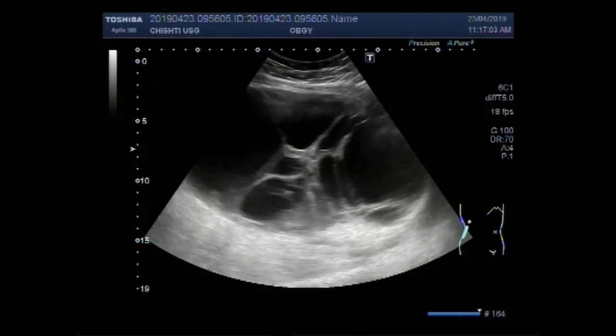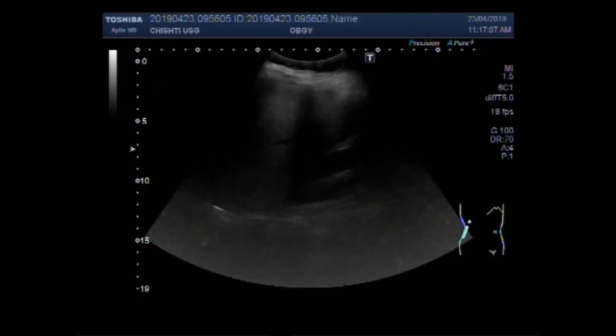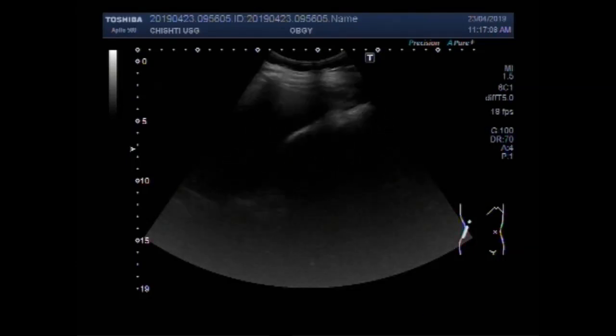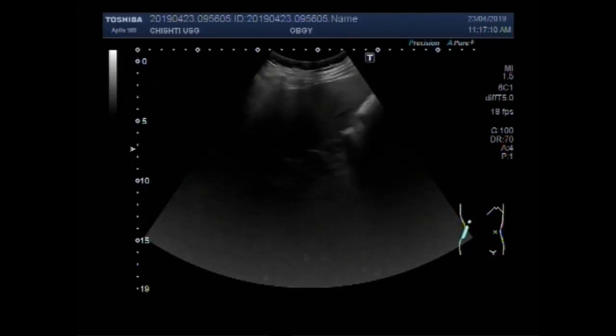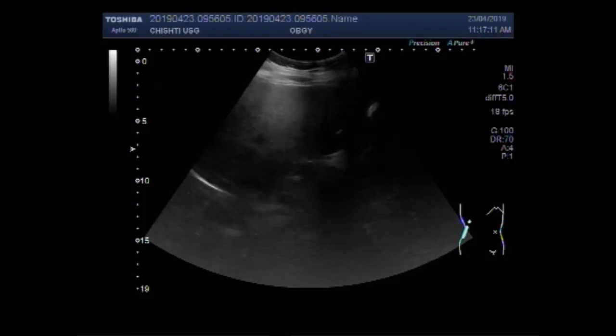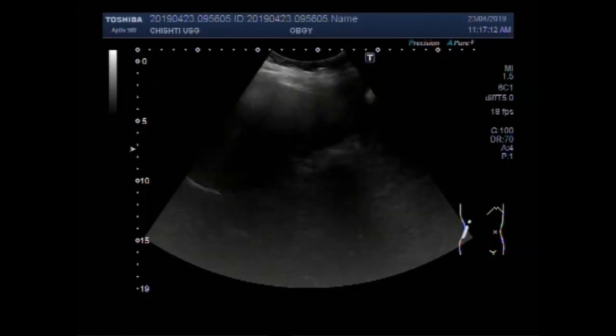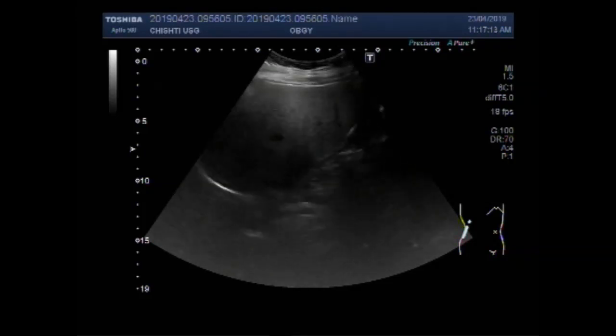Dear viewers, I hope you are all fine. This ultrasound video shows a huge ovarian cyst, a very large ovarian cyst.